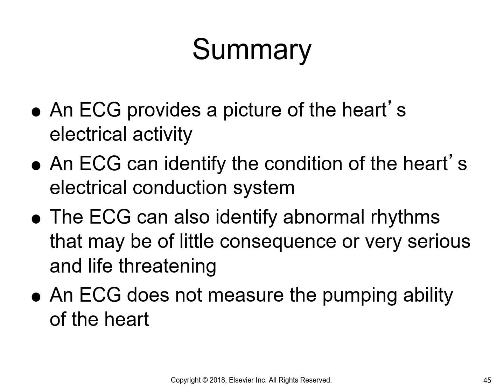All right, so again, an EKG provides a picture of what's going on with the heart. It can help identify different conditions and how we're going to treat them, and can identify abnormal arrhythmias, but it does not measure the pumping ability of the heart.